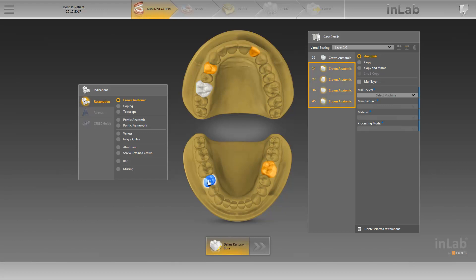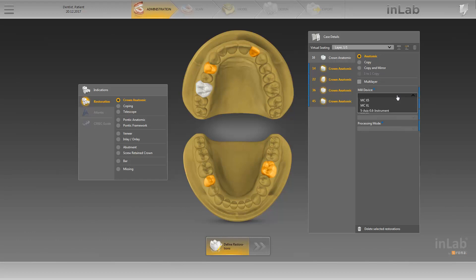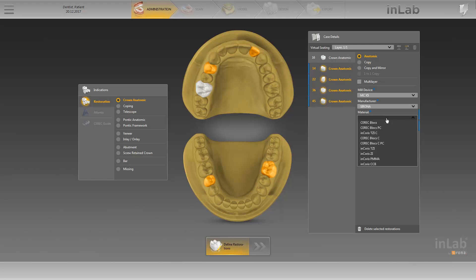We'll add a restoration in the opposite jaw and another one in a different quadrant. All restorations selected in the odontogram in succession are automatically grouped together, and the Case Details can be specified for all restorations at the same time. This requires all restorations to be made from the same material and produced on the same mill device. In this case, we select CEREC Blocks C PC.